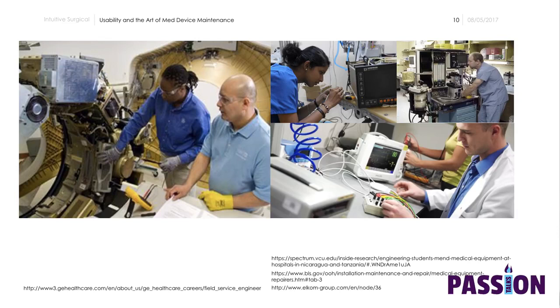I'm just showing this as a representation: there's something very characteristic when people are involved in maintaining or calibrating equipment, they're all a little stooped and hunched over in awkward positions. I think that's just a tiny window on the fact that I don't think they were the primary users considered for this activity, because of course you want to make sure it's properly used in the first case for the primary users, but there are also these other users as well.